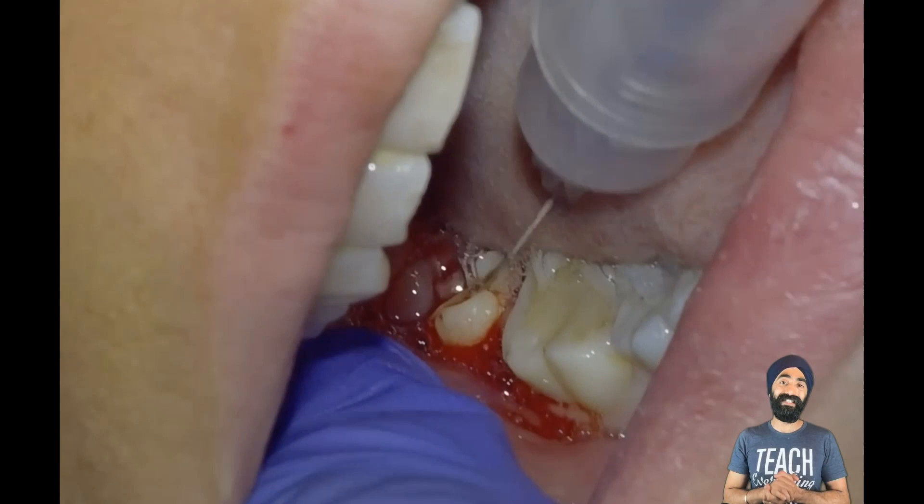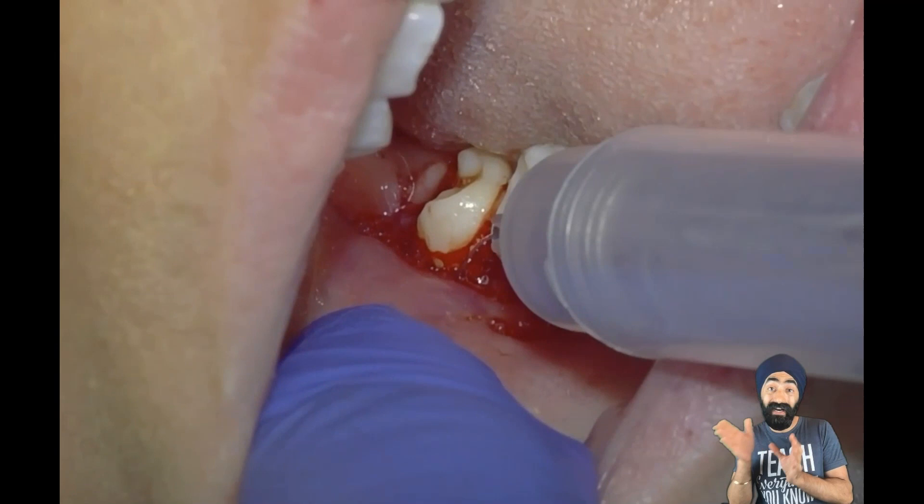I start with some anesthetic for that chronic area of inflammation, which may interfere with the anesthetic. I also give a little bit of buccal infiltration into the attached gingiva, and that helps to reflect the flap much easier.